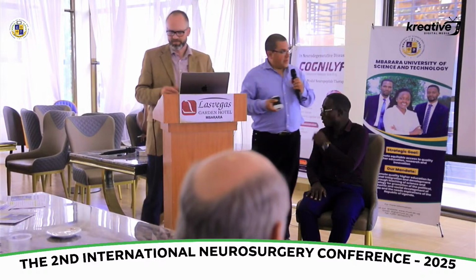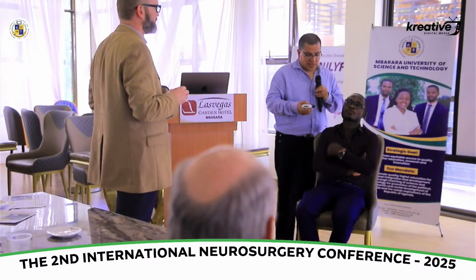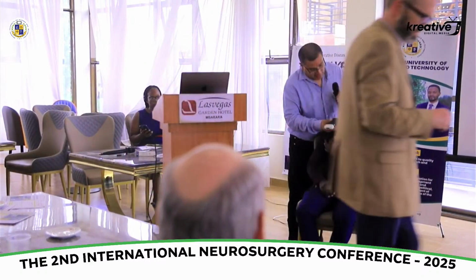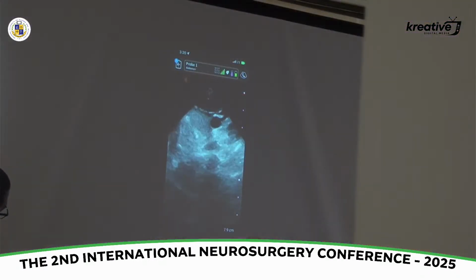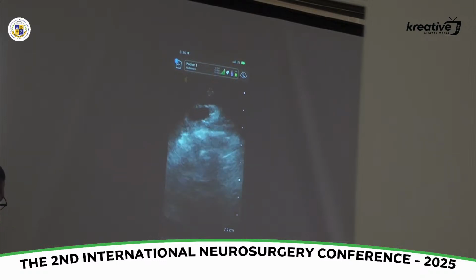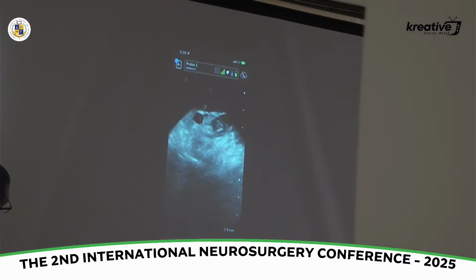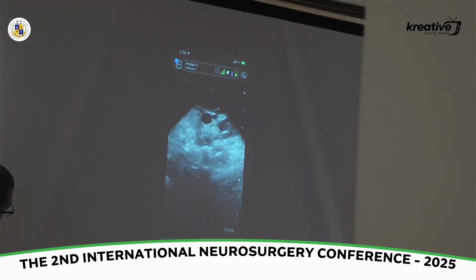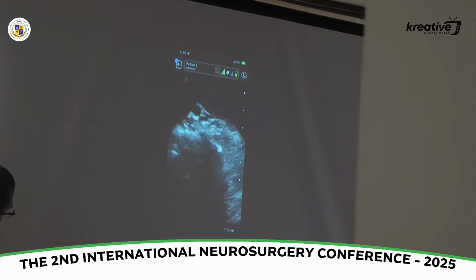All right, we're going to demonstrate a quick Doppler. Obviously, this will be the extracranial portion of it. Joseph, thanks for being my model today. I usually start fanning from the bottom of the neck and get a good image. So you can see right there an actual view of his ICA, and we'll follow it all the way up to the base of the skull.